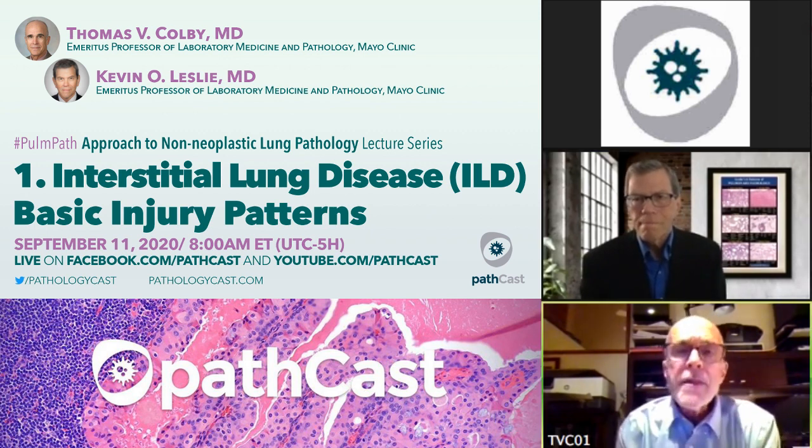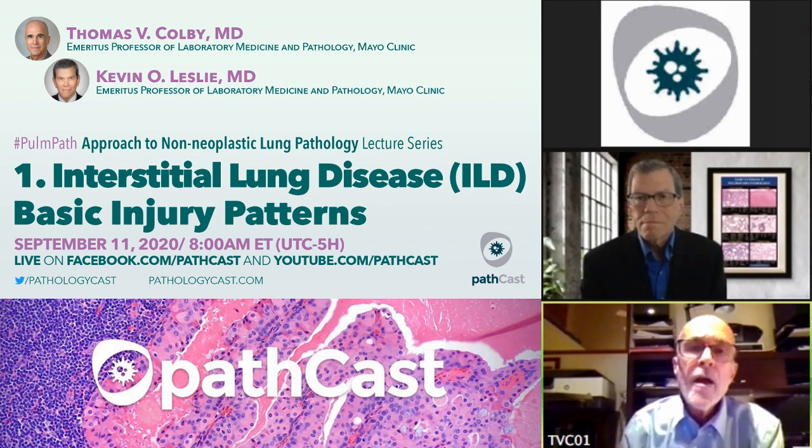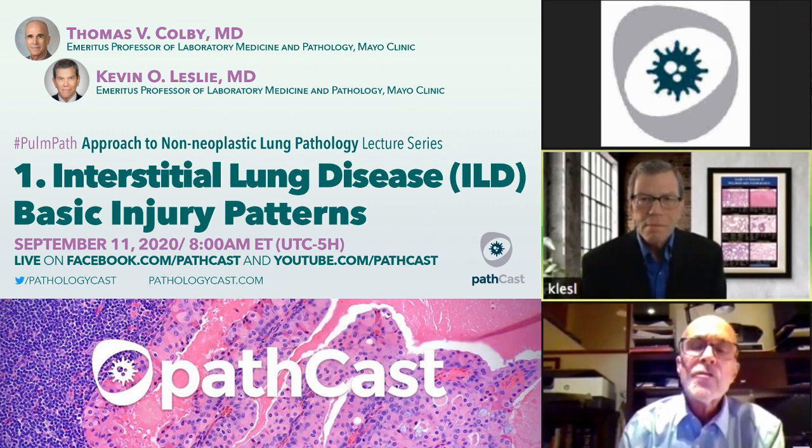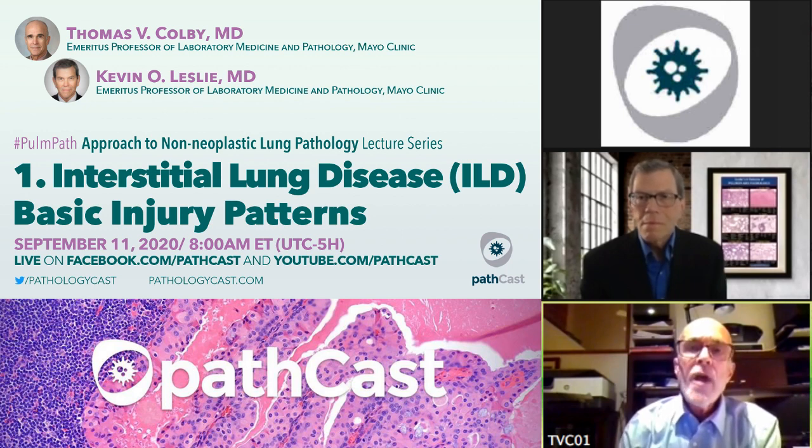Yeah, no, I agree. I think that in the autopsy studies that have been done, there's a little more often hemorrhage, a little more often thrombi, and sometimes small infarcts in COVID cases of DAD compared to other DAD, but I'm not sure that you could hang your hat on that as a diagnostic finding.